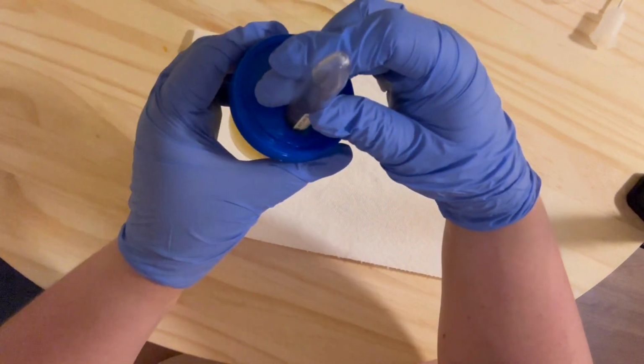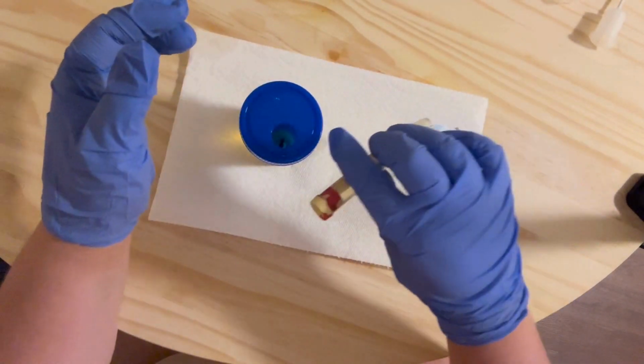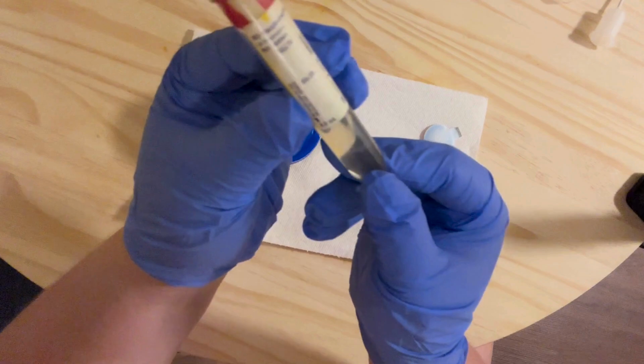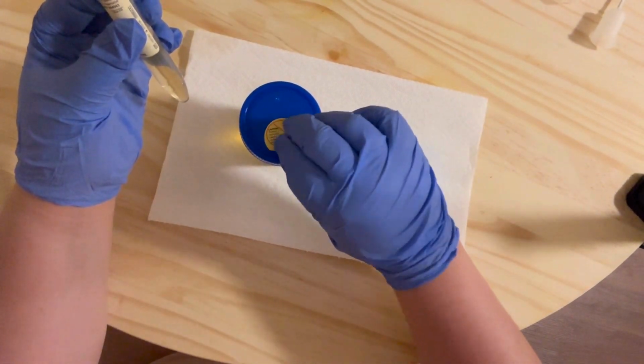For catheterized specimens, a urine sample is taken by inserting a thin, flexible tube or catheter through the urethra into the bladder. But in this demonstration, I'll be using a thin, flexible tube inserted exactly right into the container of the specimen. The urine is collected in a sterile container at the other end of the tube.